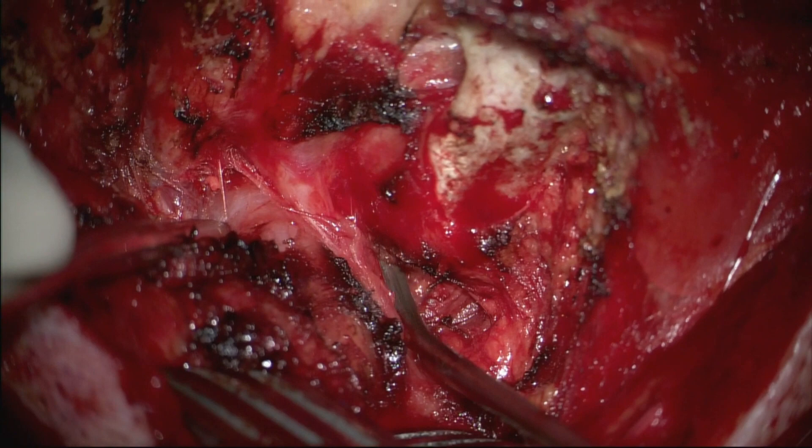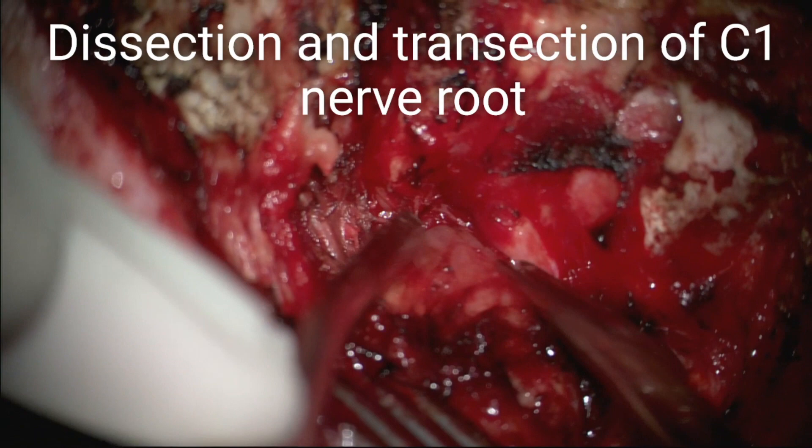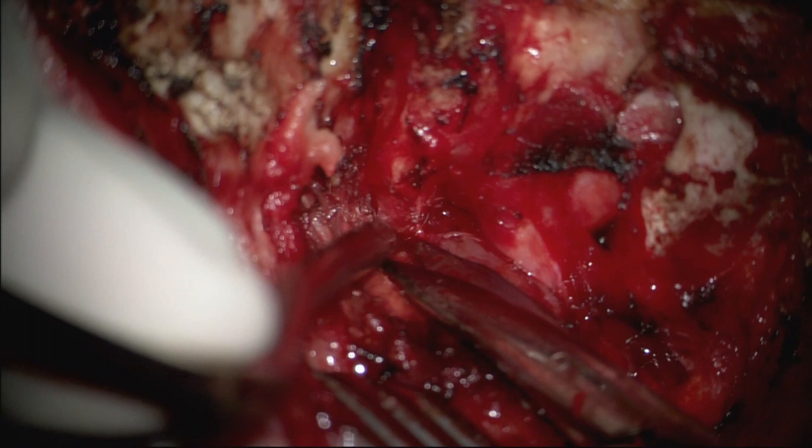The C1 nerve root is identified and sharply transected to allow for greater access to and mobilization of the looped V3 segment entering the transverse foramen, which is visualized during gentle blunt dissection.